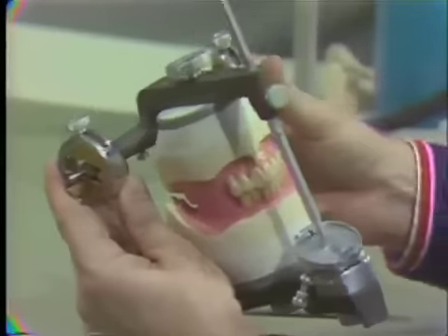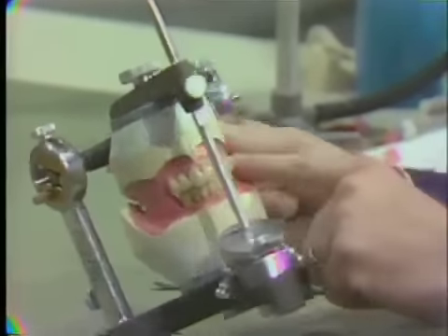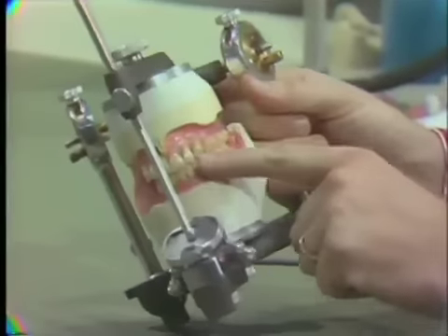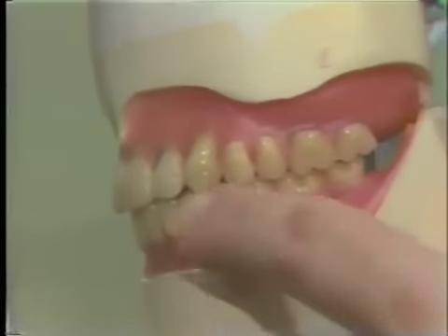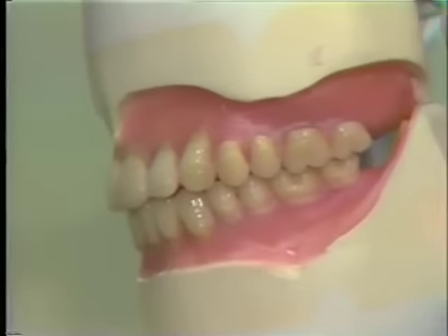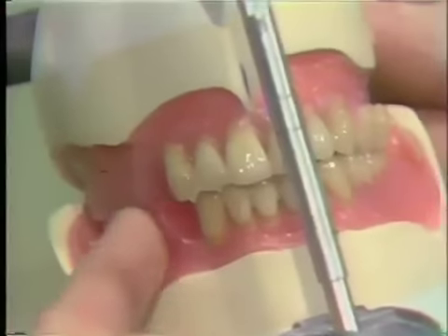In denture balance, we are talking about contact on the working side — as the jaw comes toward you, we should have smooth gliding occlusion through all the posterior teeth, and at the same time have contact all the way along the other side.